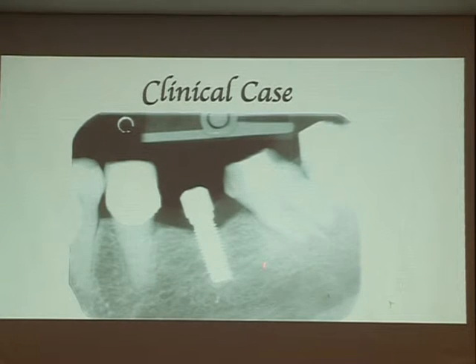I was distracted by the implants. I hate implants, okay? And the dentist hates implants. I was distracted. They asked me, can I do this one? I said, of course, no problem. Because my attention was attracted by the implant. So I committed to do this retreatment on the 3-7. In the second visit, I really started my treatment.